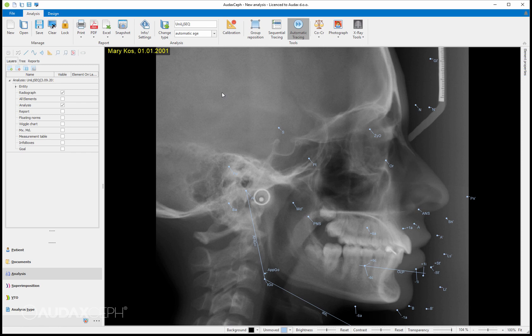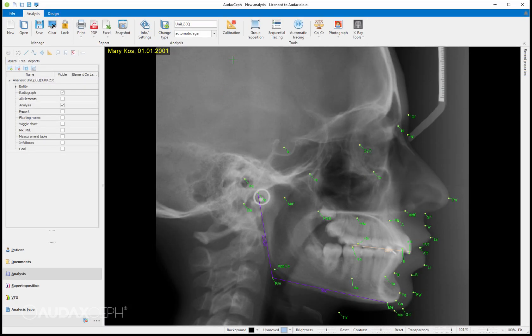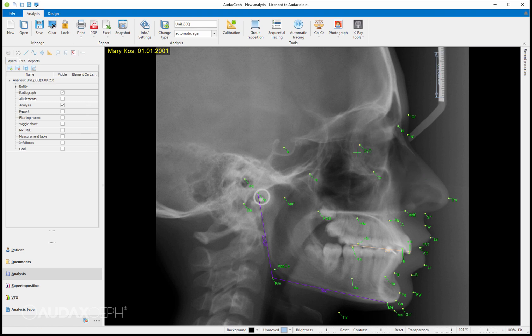I'm going to do the automatic tracing and we'll do the calibration. I push this button and I say from here to here is 25 millimeters and I can say okay.